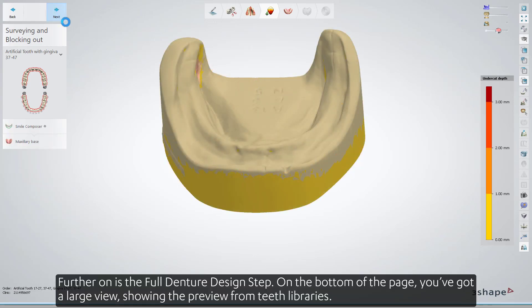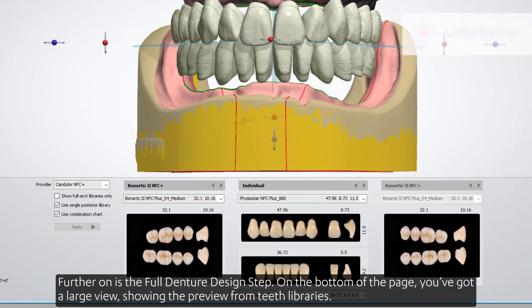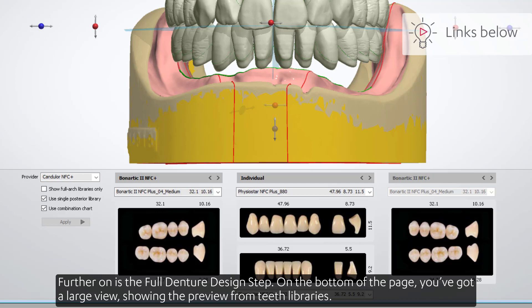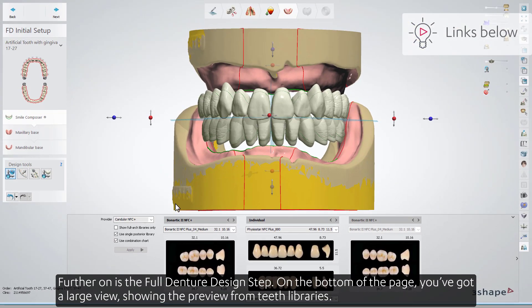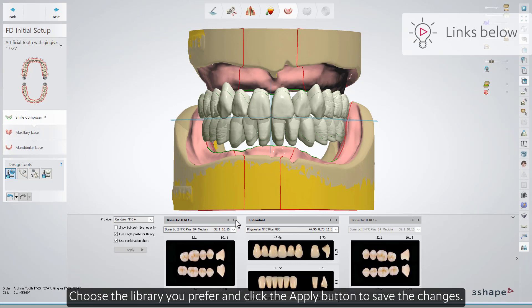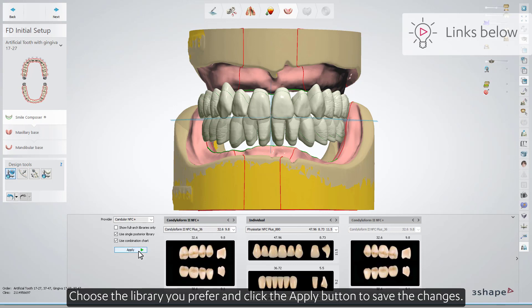Further on is the full denture design step. At the bottom of the page, you've got a large view showing the preview from teeth libraries. Choose the library you prefer, and click the Apply button to save the changes.